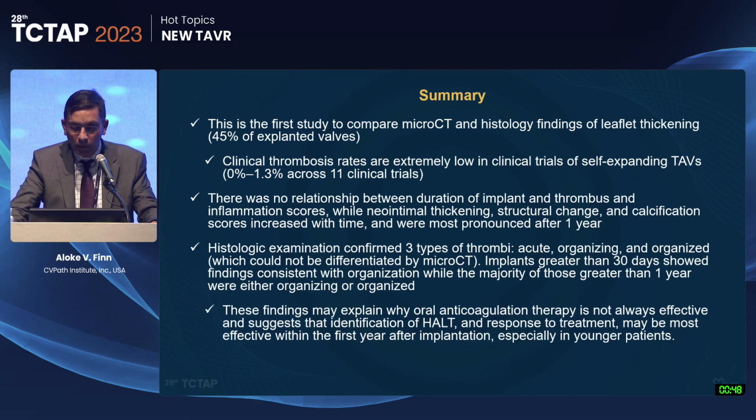These findings may explain why oral anticoagulant therapy is not always effective and suggest that identification of HALT and response to treatment may be most effective within the first year after implantation, especially in younger patients.